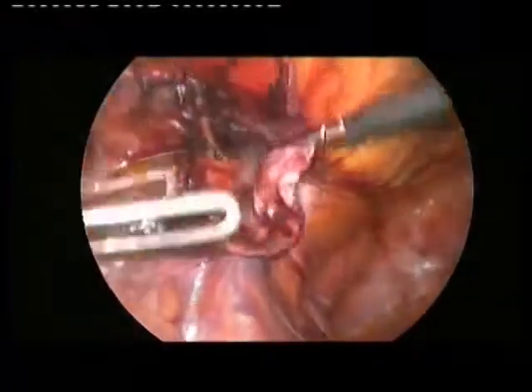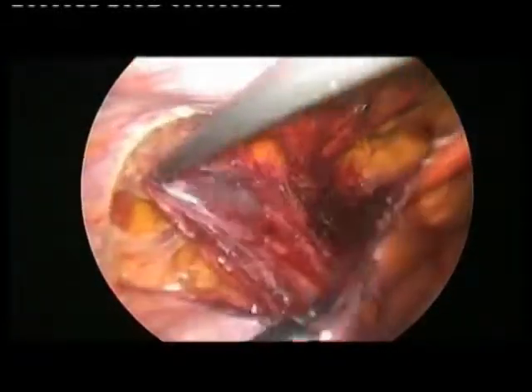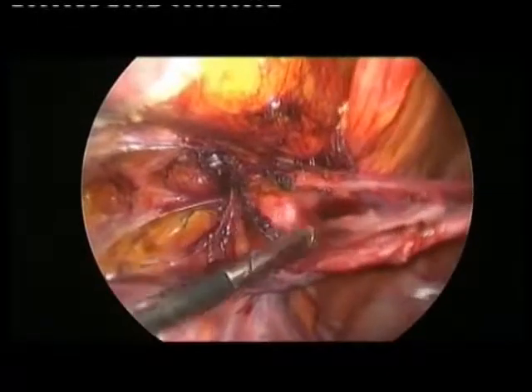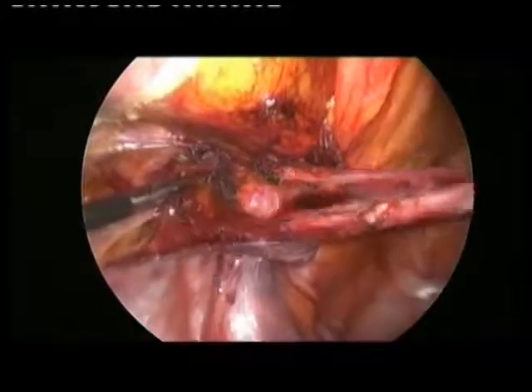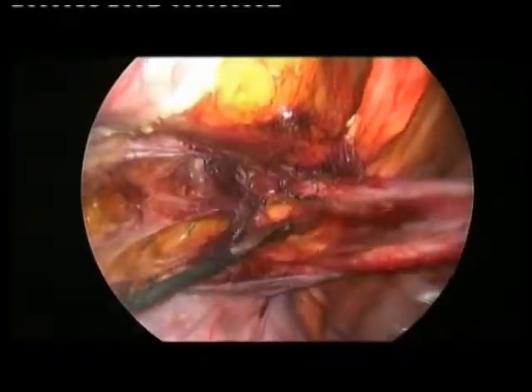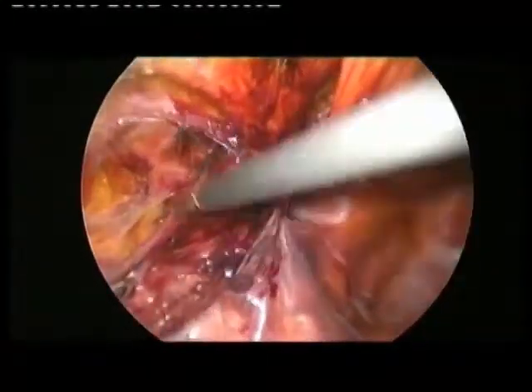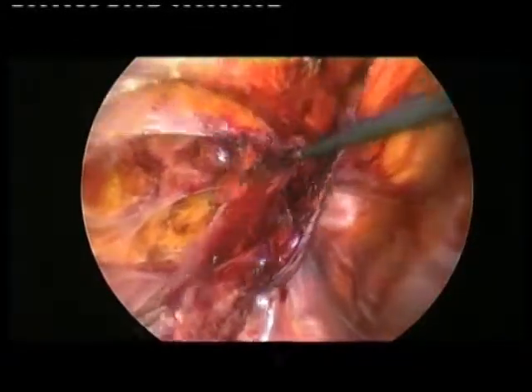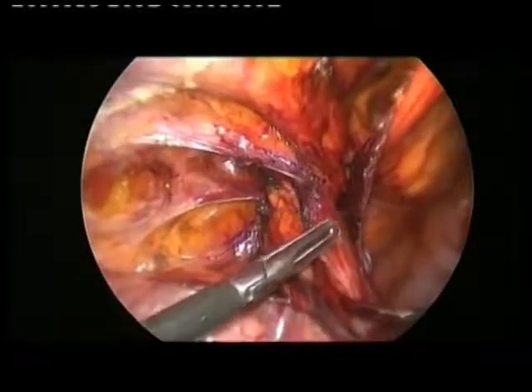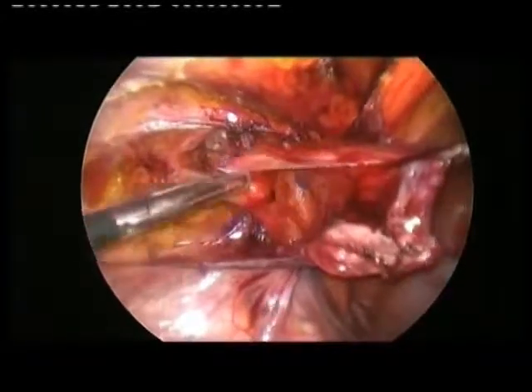Yes, I hear. Ok, so this is the sac. I'm going to reduce the sac, you see? This is the sac. It's a long sac, and we are going to reduce the sac and dissect it from this, that are the spermatic vessels, and now I'm going to show you the deferent, okay? I think this hernia is very similar to the hernia that Professor Duluc operated. Same indirect hernia, okay? I'm going to finish the dissection. It's very important now to check for the deferent.